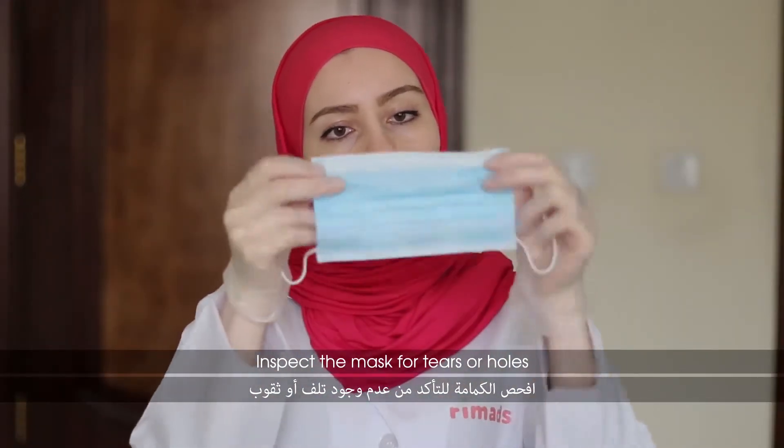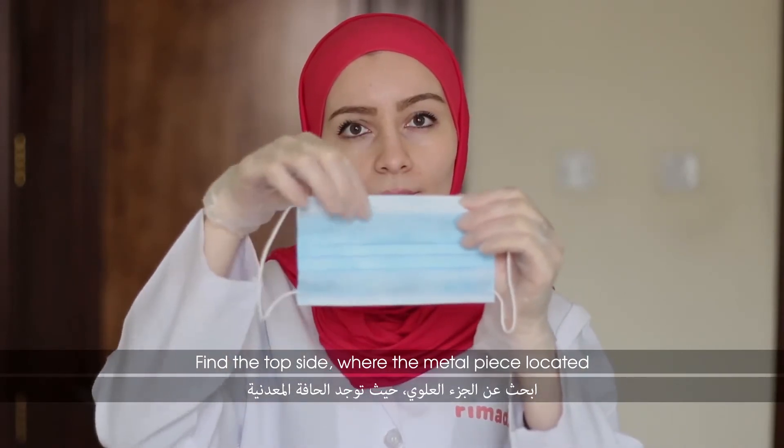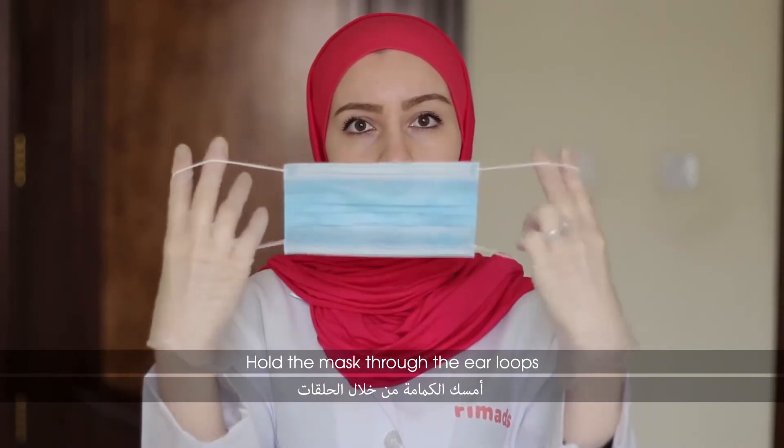Inspect the mask for tears or holes. Find the top side where the metal piece is located, and hold the mask through the ear loops.